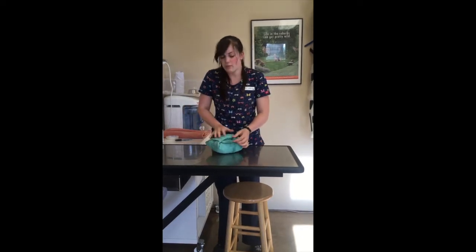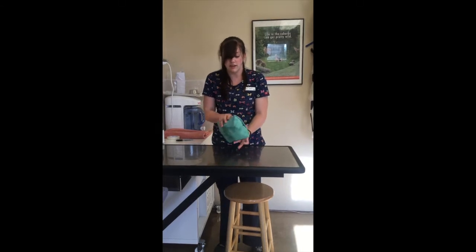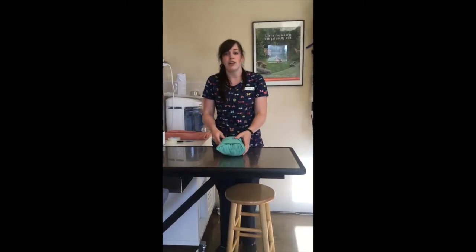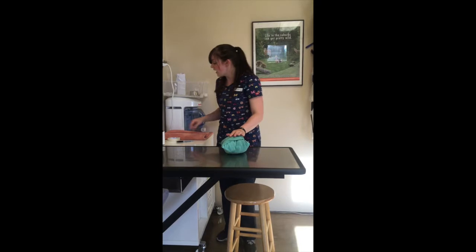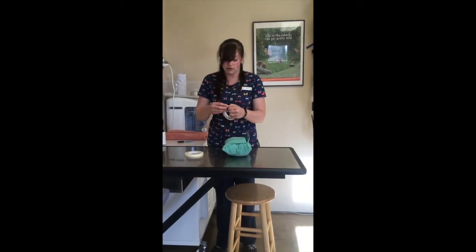Alright. Now that the pack has been wrapped, it's nice and snug. And you can see that there are no openings to the inside of the pack, so there's no chance that there'll be a break of sterility for that. Then I'm going to go ahead and secure my pack closed.